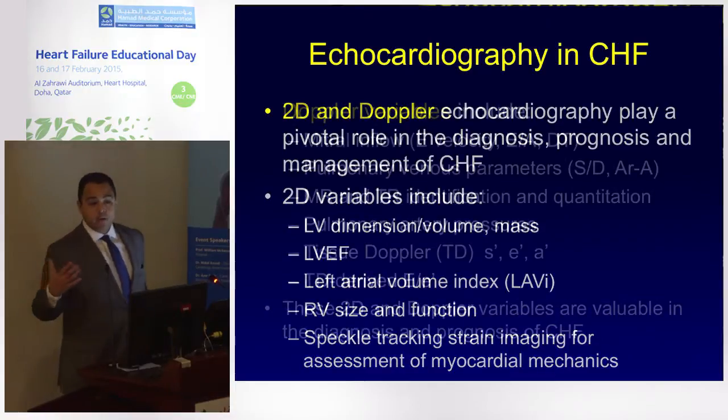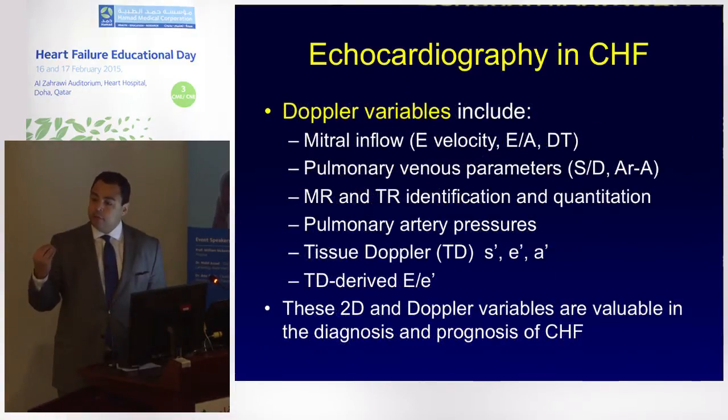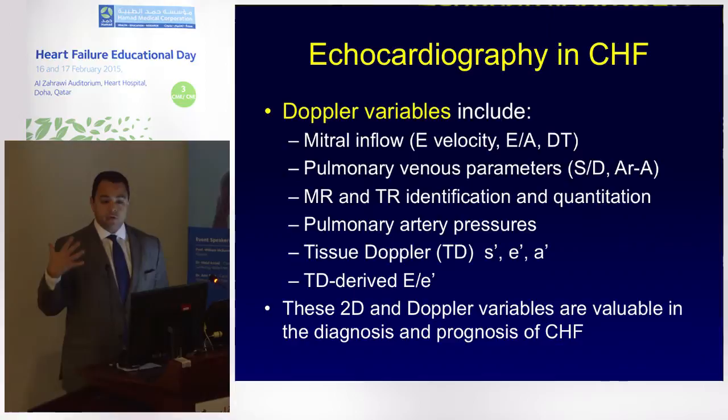Now, Doppler is basically the transmission of ultrasound, which reflects off a moving object, and the shift in the frequency of the Doppler is used to calculate velocity, speed, and direction of that object. Whether that object is a red blood cell with blood flow, we can estimate regurgitation, transmitral inflow, filling pressures, right-sided pressures, or even tissue Doppler imaging, when we flip the wall filter so we measure the velocity of the myocardium, which is very helpful.